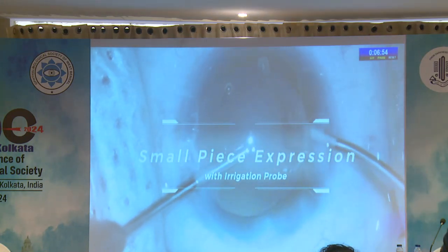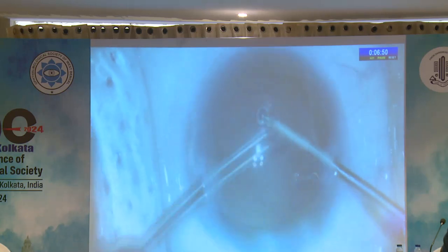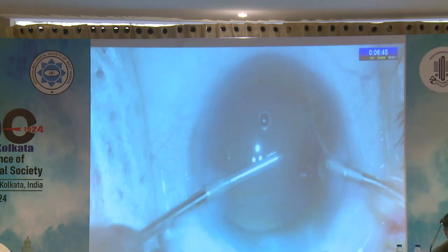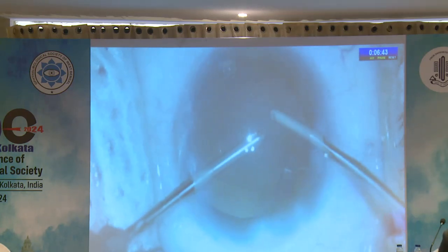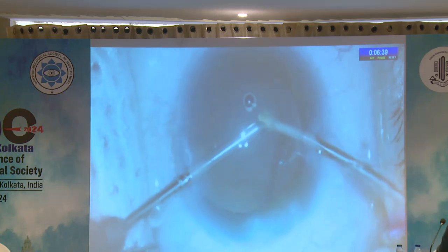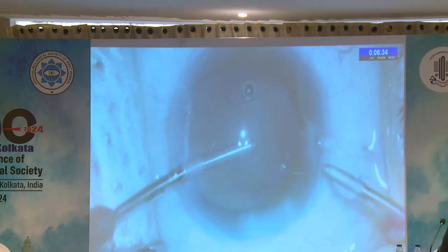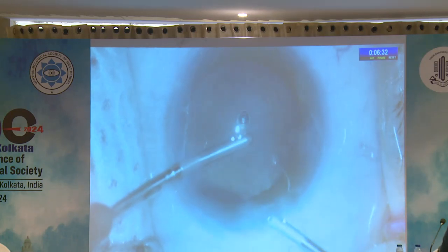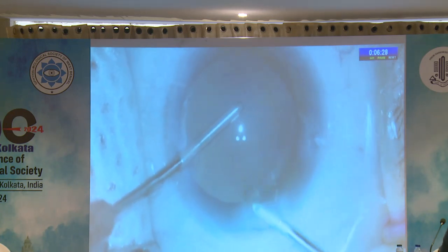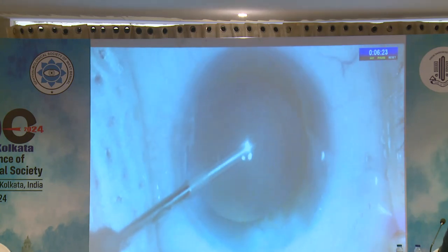Now this is a second situation where we often see a small piece of cortical fiber or an epinuclear plate which does not enter into the suction probe. So what we have to do is to express it out, but it often doesn't come out very easily, and for that what we can do is stop the irrigation so that it gets free, and then when we press the lower lip of the main incision it just comes and gets stuck into the main incision.